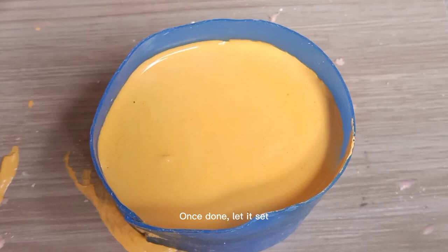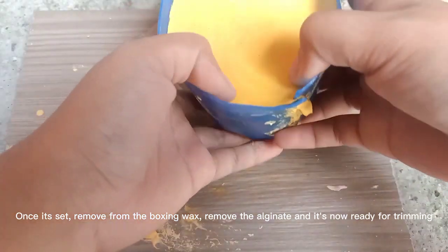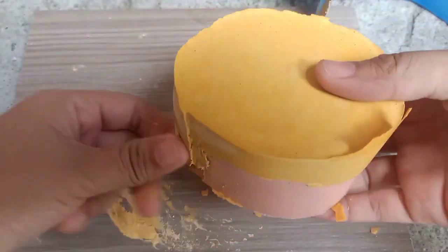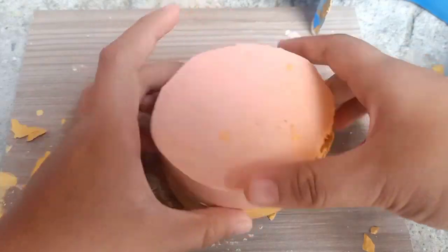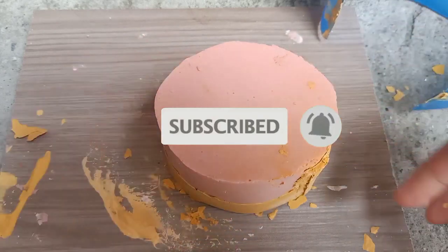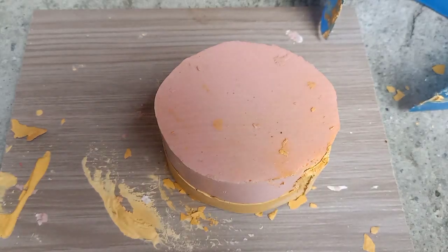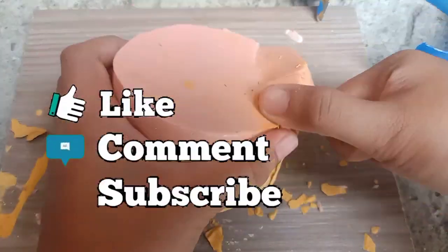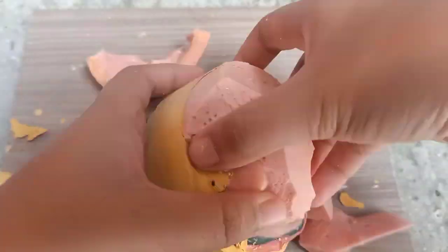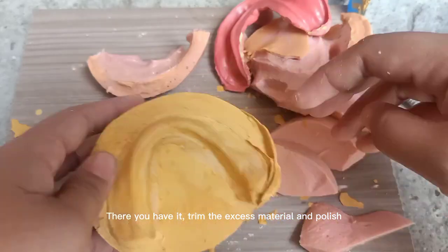Once done, let it set. Once it's set, remove from the boxing wax. Remove the alginate and it's now ready for trimming. Trim the excess material and polish.